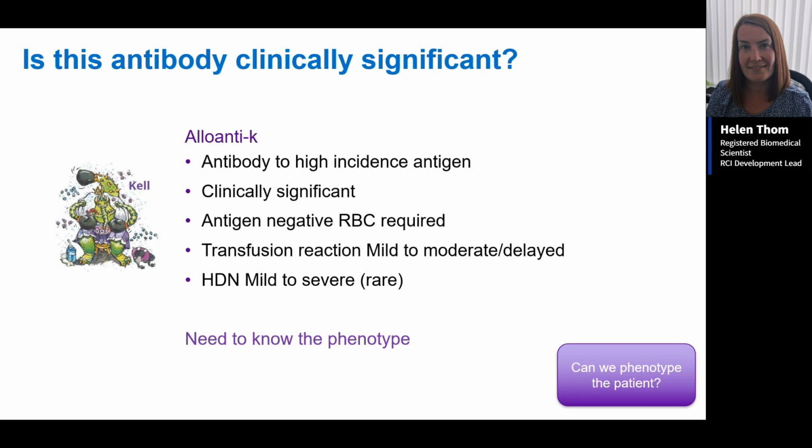Yeah, so I've got a few different answers coming in there. A few people have said you can phenotype the patient. 66% have said you can't phenotype them because they're recently transfused, and 28% have said that you can't phenotype them because they're IgG DAT positive.